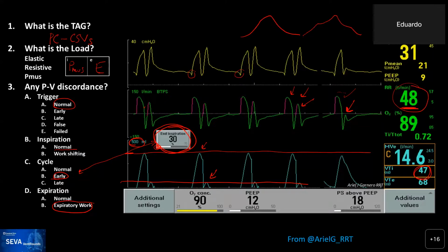And so in these patients with very high elastic load, it's an issue. So perhaps in patients that continue to do that and still have these errors, you could potentially use systems like pressure control. So you set the I time at the measured I time that the patient needs, and you do that just to get rid of the multiple triggering and the dyssynchrony that comes with that.